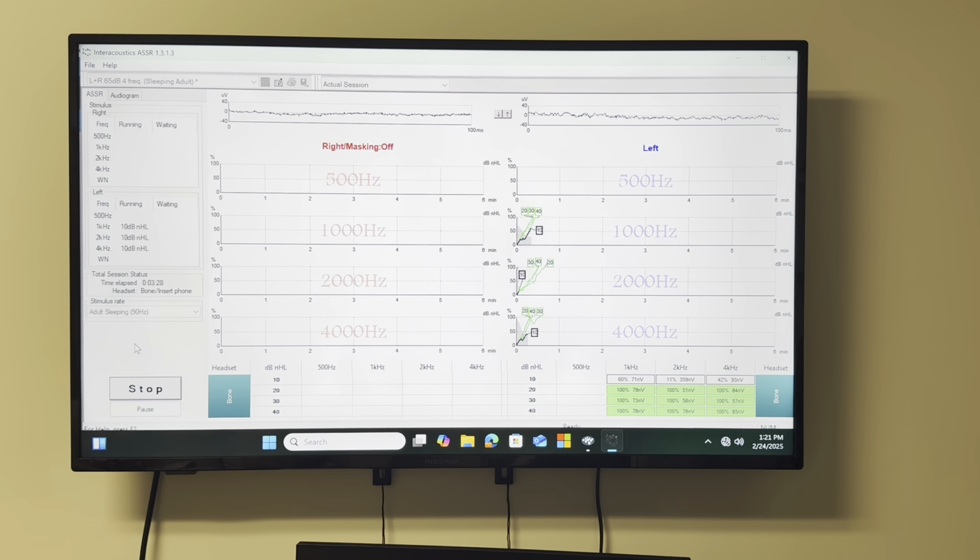Of the opposite ear, that's what you're saying? Opposite or test ear, both ears. If they hear in any ear, it'll help you, both ears, just to see how much is leaking out, how much goes to the other ear? Yeah, test ear also.